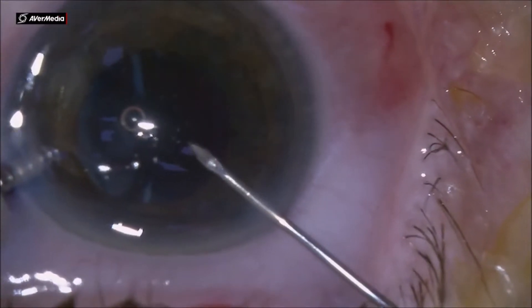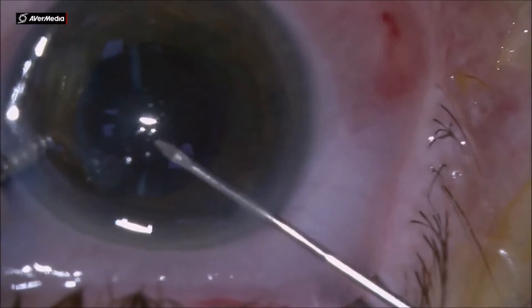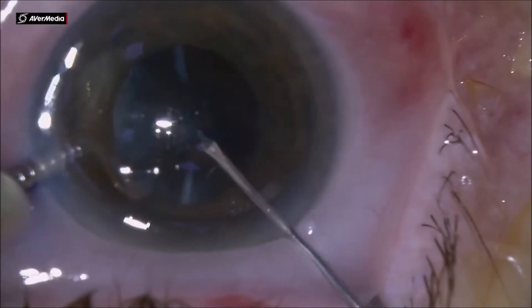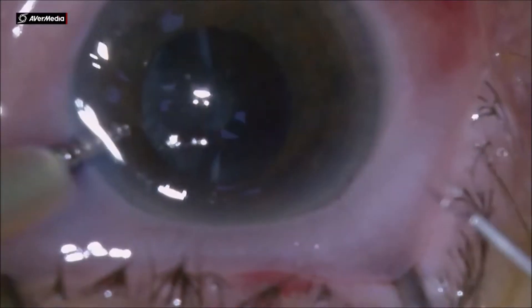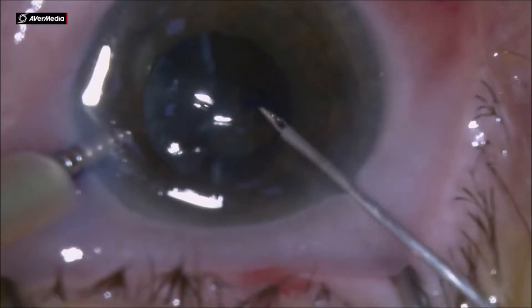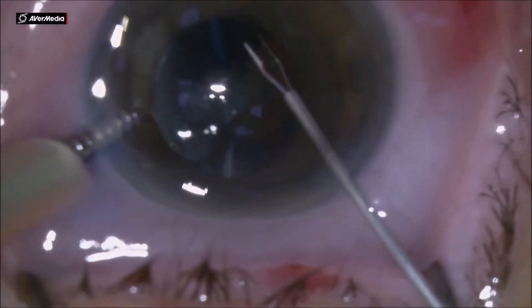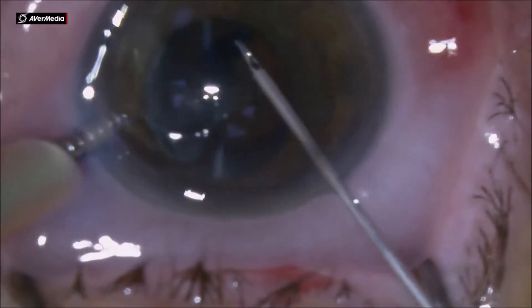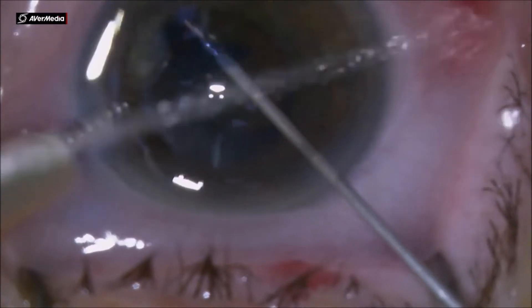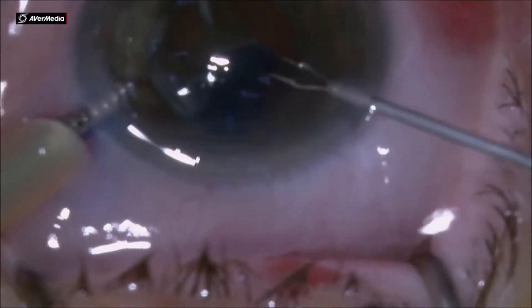I do the staining of the anterior capsule and then with the cystotome I break the anterior capsule in order to have the capsulorrhexis done with Graefe forceps. Using the 25 gauge forceps it's easy to have good control over the capsulorrhexis and to make it a little larger than the pupil size.